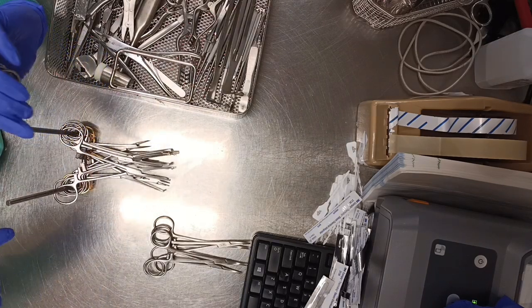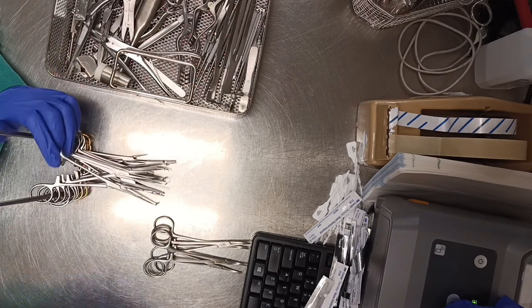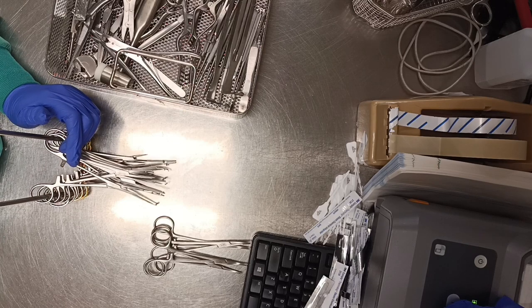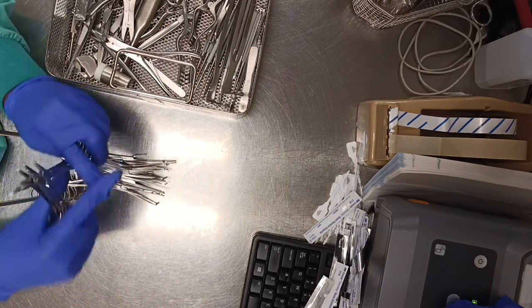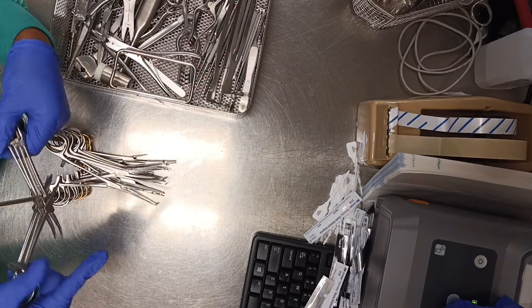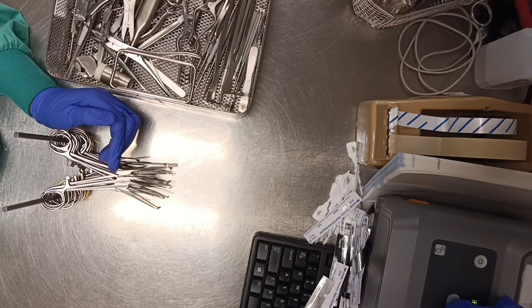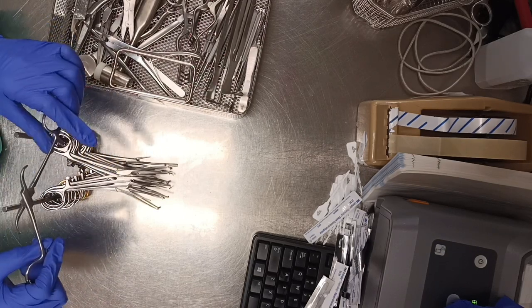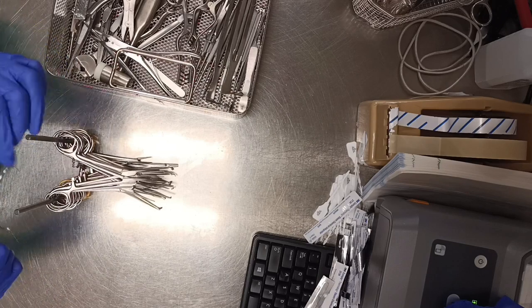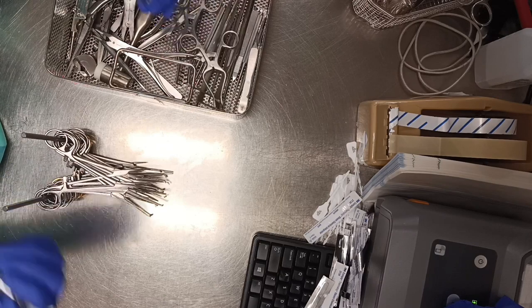This right here is the Kelly. In other hospitals, it's also called the hemostat. That is the Kelly straight or the hemostat straight. The next instrument is going to be the curved hemostat. As I always say, make sure you look through them, make sure everything is clean and good. In cases where you have dirt on an instrument, you have to send it back to decontamination, and then you replace it with a new instrument. Never should you send a dirty instrument to the OR.